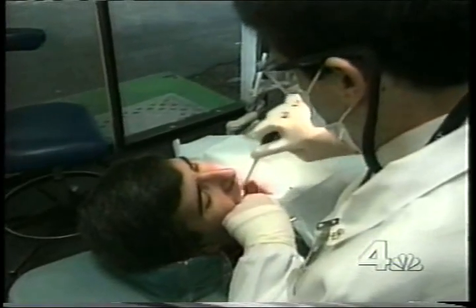Enter the laser. The advantages: no pain, no swelling, no fear.